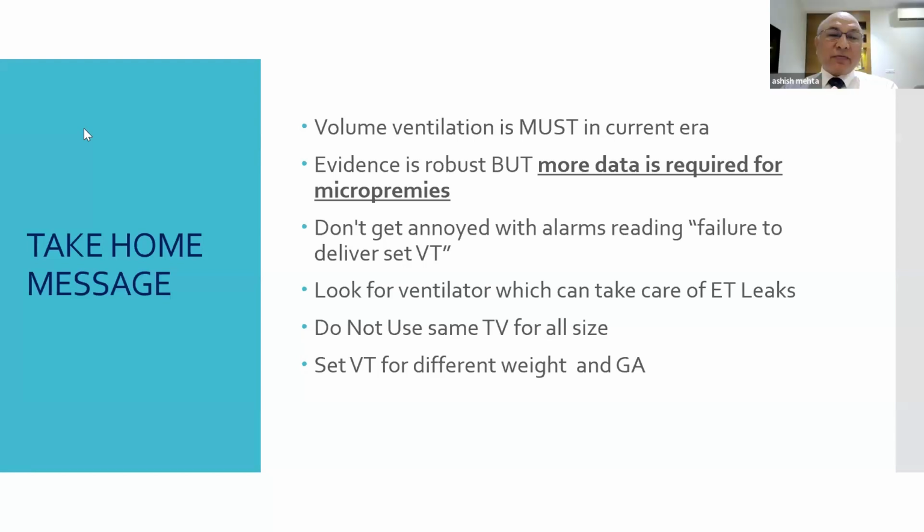Pressure control. See, the problem with volume ventilation is you need a good flow sensor. And that is always a problem with busy nurseries, because the flow sensor, as you know, is a very sensitive thing with the secretions, with the cleaning, the way it is handled. Without a proper flow sensor, the numbers will not work. In that case, I'm happy with basic ventilation rather than going for sophistication. Stick to your basic principles. As I told you, we do not have many babies who need this sophistication.